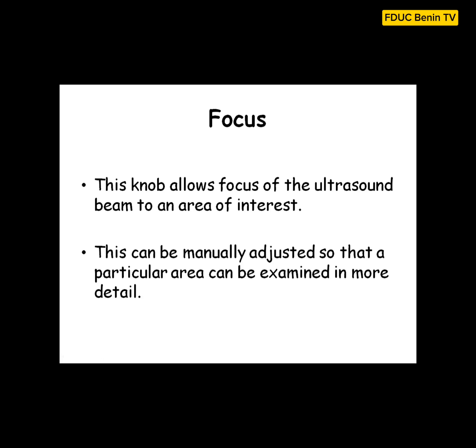You can manually adjust this as you scan. On some machines, you just see the button for focus, and as you move the knob, you see the marker moving.